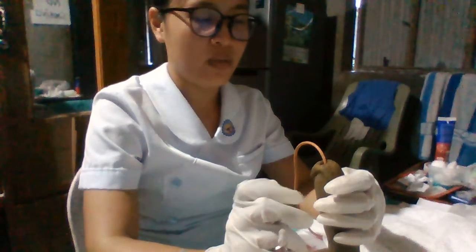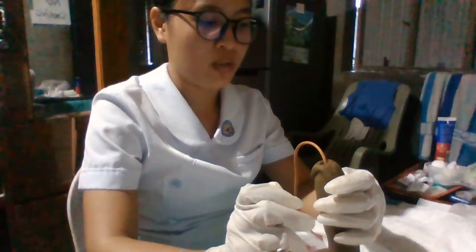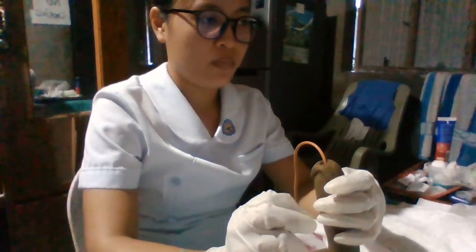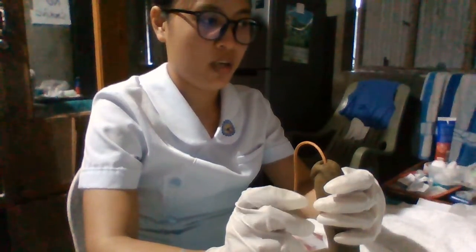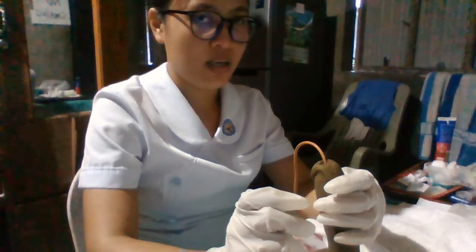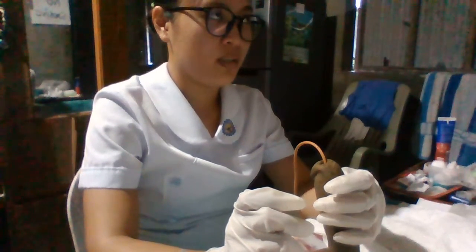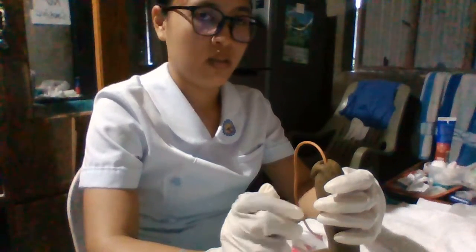If there is a discharge, we're going to note the amount, color, odor, and consistency of the discharge, and we're going to ask the client if he feels any burning sensation or any discomfort.